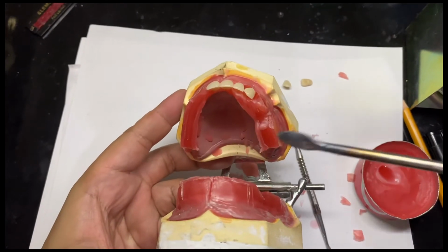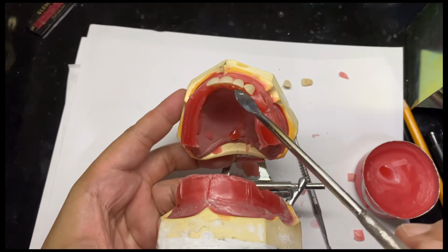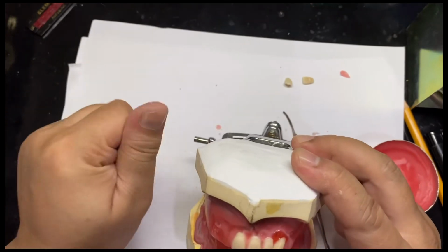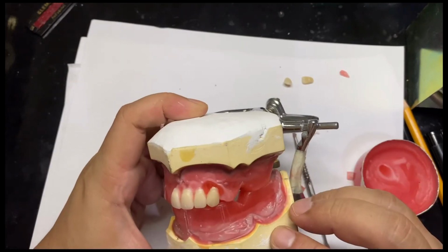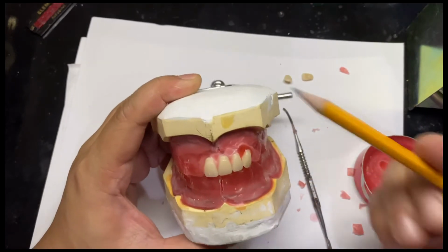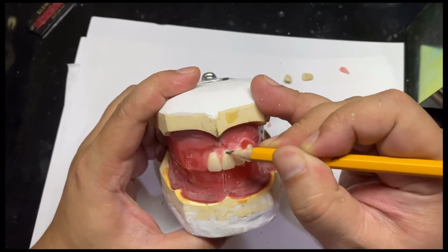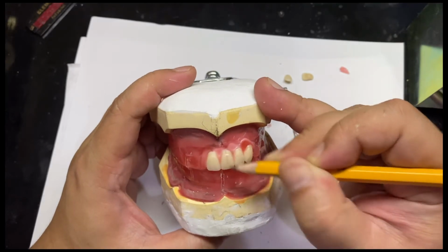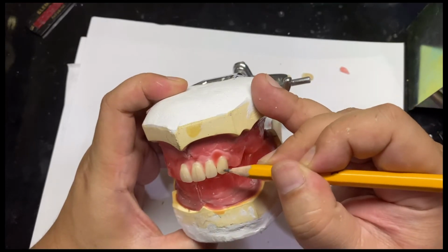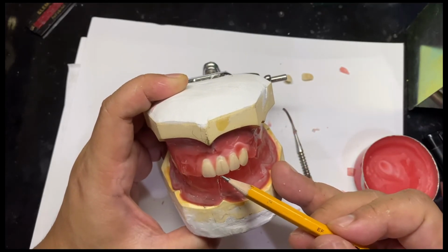And then remove some part on the lingual area, and wait for it to set. The central incisor is set straight up and down, and then the lateral is distally inclined, same as the canine. It's distally inclined, but look at the incisal edges. It follows the occlusal plane.